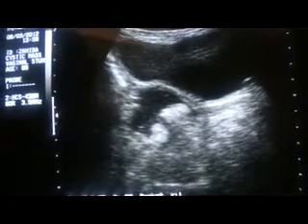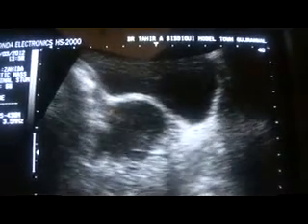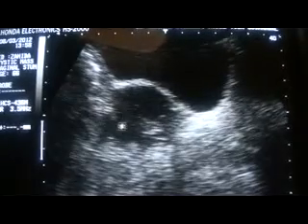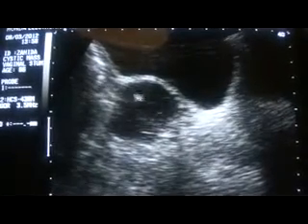So this is a case study of a pelvic cyst that is complex, relating to the vaginal stump, well-demarcated, with tiny internal calcification and marginal calcification. The area where the star is blinking is a tiny calcification giving a sharp posterior shadow — this is internal calcification within the cyst. There are marginal and internal tiny calcifications along with thick echogenic material that does not give any posterior shadowing. This is the pelvic study and pathology in this female.